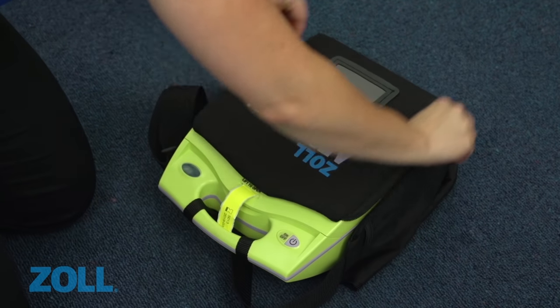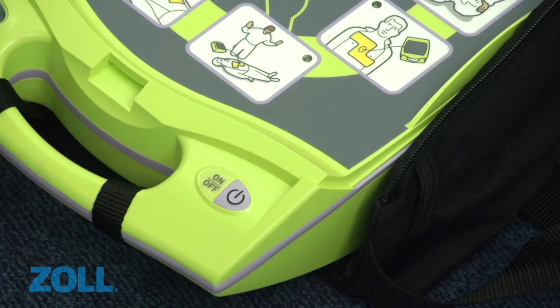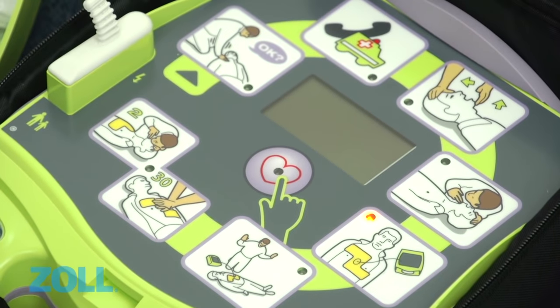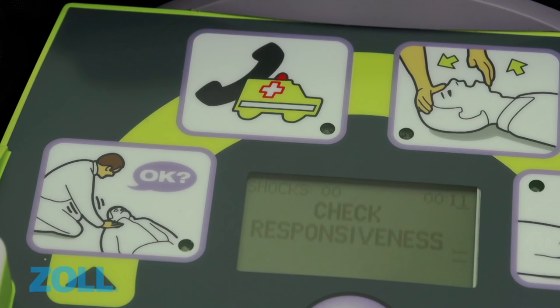Upon reaching the patient, remove the lid of the AED Plus and turn it on. Follow the audio and visual prompts through each stage of the life support process. An LED light will indicate which step you should focus on. Check responsiveness.